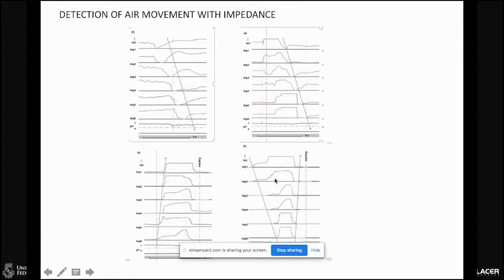And finally, there is the most interesting of the models: air that is moving in and out within the esophagus. This air never reached the stomach. So this is a liquid swallow, this is aerophagia, this is a gastric belch, a typical belch coming from the stomach, and this is a supragastric belch. It's air that is coming into the esophagus and it is eliminated out of the esophagus.